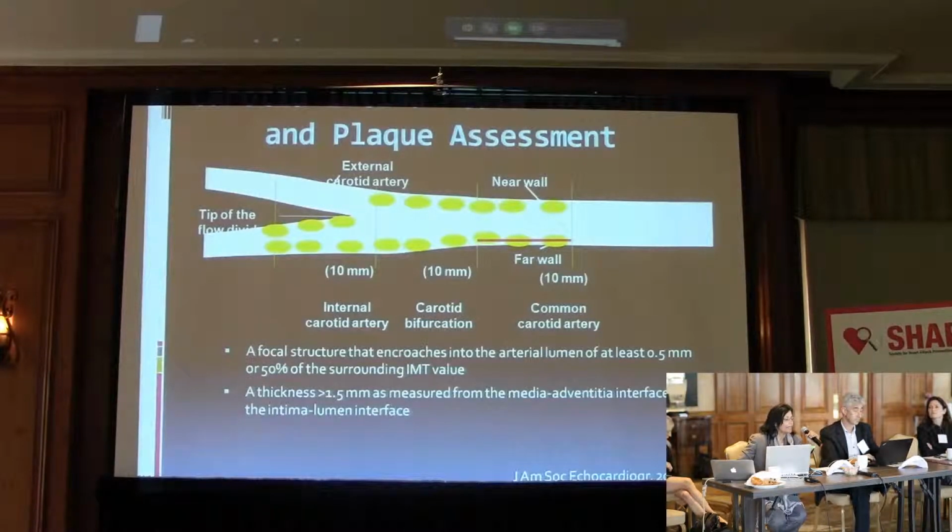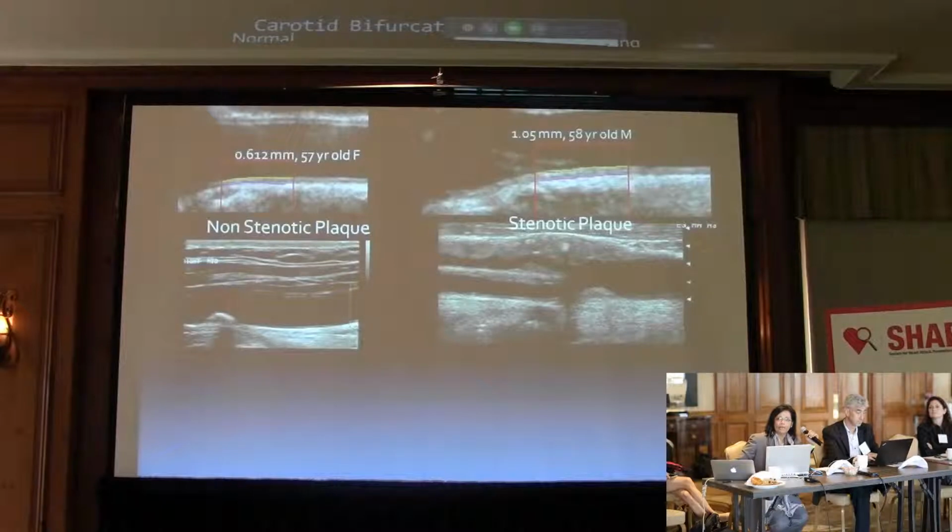And then secondly, if they identify a plaque, most of the studies have just limited themselves to plaque yes or plaque no. It's as if saying coronary calcium yes, coronary calcium no. And obviously if you were to take that approach, you can again understand why there has been a limitation in the predictive value of even plaque.